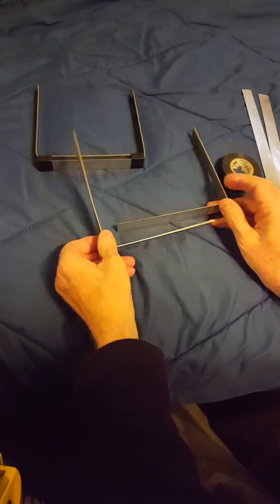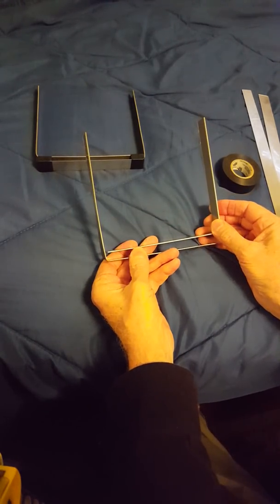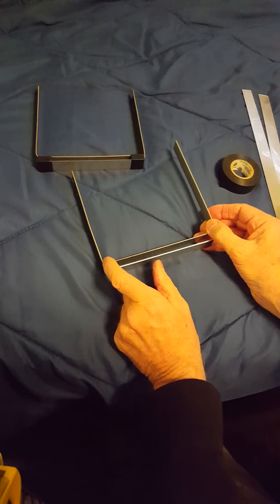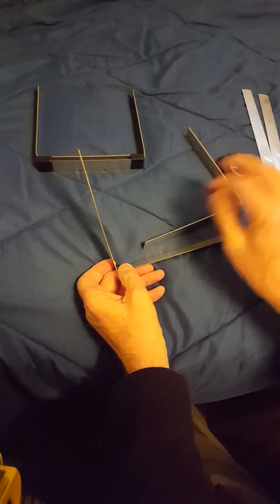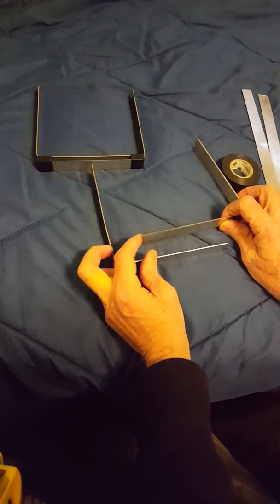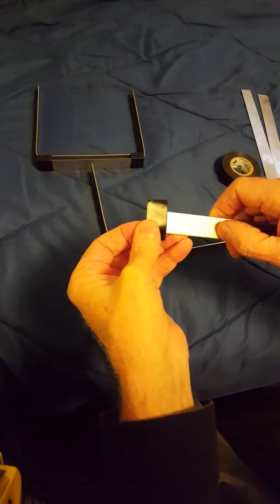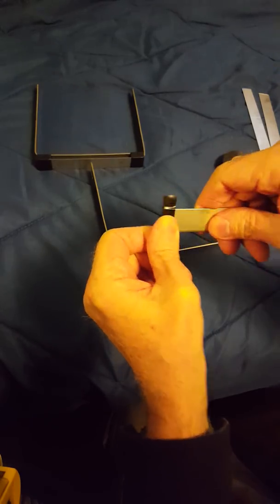The first thing that you need to know is that these slide almost touching right here. And if you know anything about electricity, it'll follow the path of least resistance. This is a 1/4 inch gap. This is almost no gap. So if this is unprotected, it will put all that current into the base here and literally just cut this piece off and your device will be ruined. So the first thing you do with these is you protect this end, which is very easy to do. Get yourself some electrical tape and let's tape over this like that.